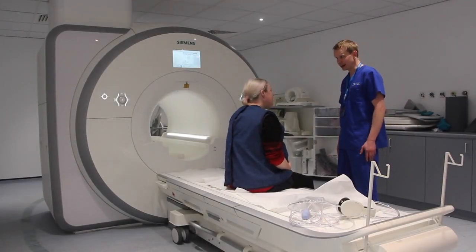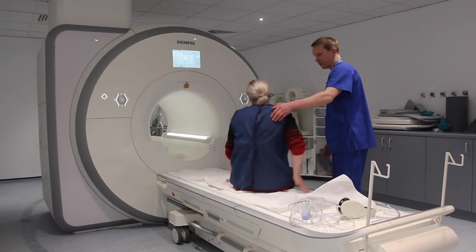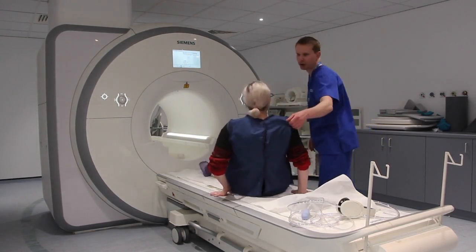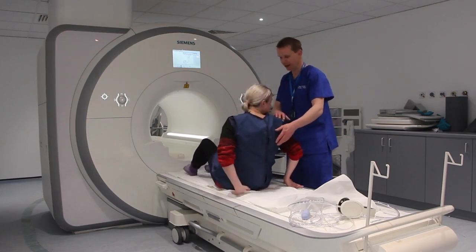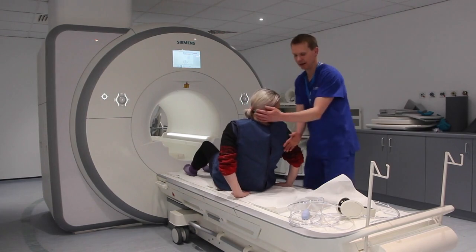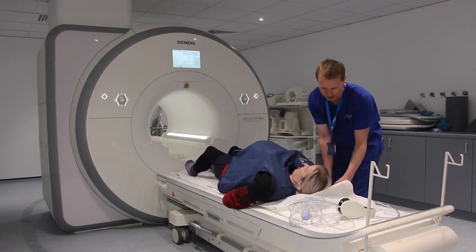On entry to the magnet room, check with the patient if she can lie comfortably on her back. If the patient can lie on their back, that is the easiest position. However, in the late stages of pregnancy, the gravid uterus can compress the IVC, reducing venous return, and can cause the patient to feel faint or sick.